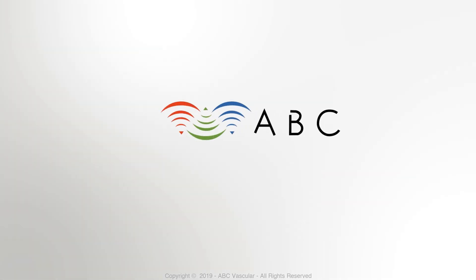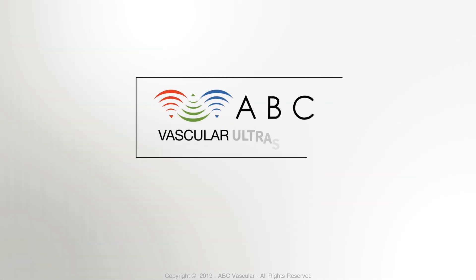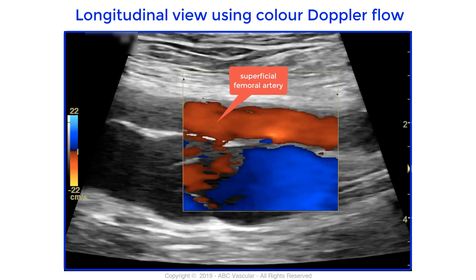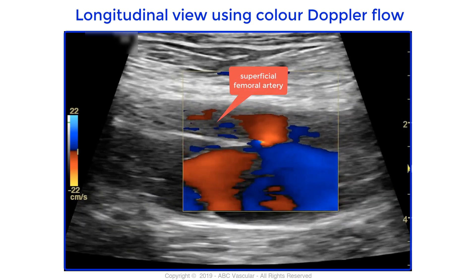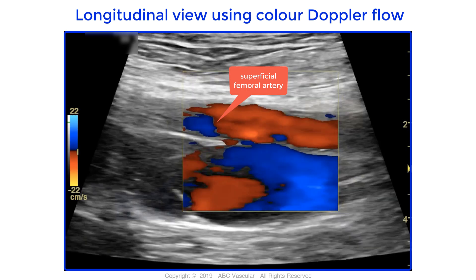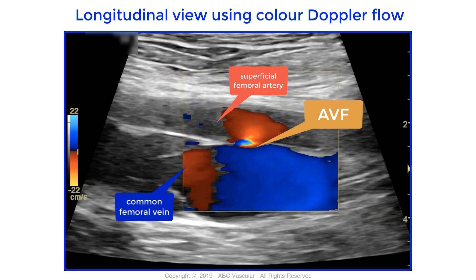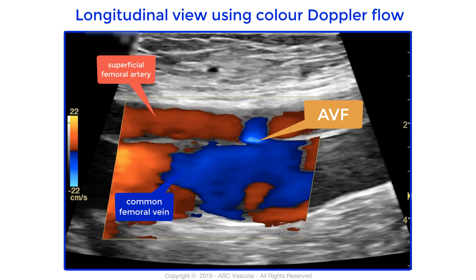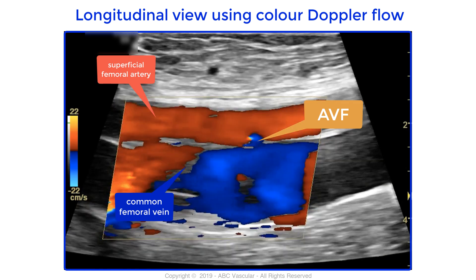Welcome to this ABC Vascular Ultrasound case study: the iatrogenic arteriovenous fistula between the superficial femoral artery and the common femoral vein. In this longitudinal view using color Doppler flow, you can visualize the superficial femoral artery anteriorly to the common femoral vein, and a communication between these two vessels via an arteriovenous fistula.